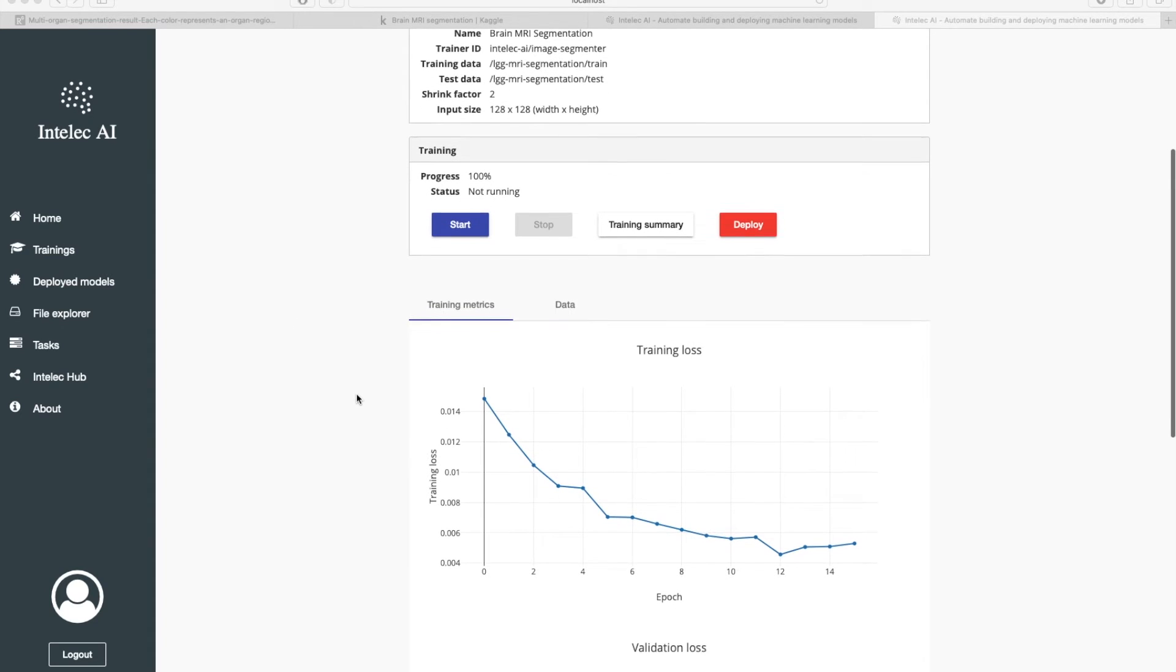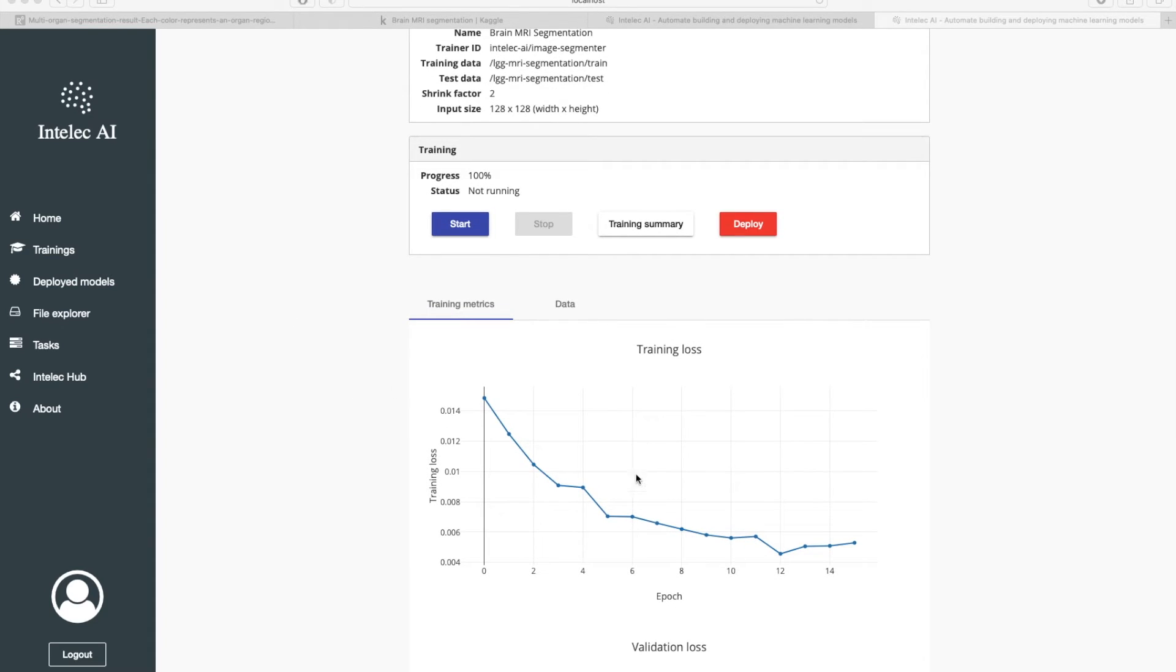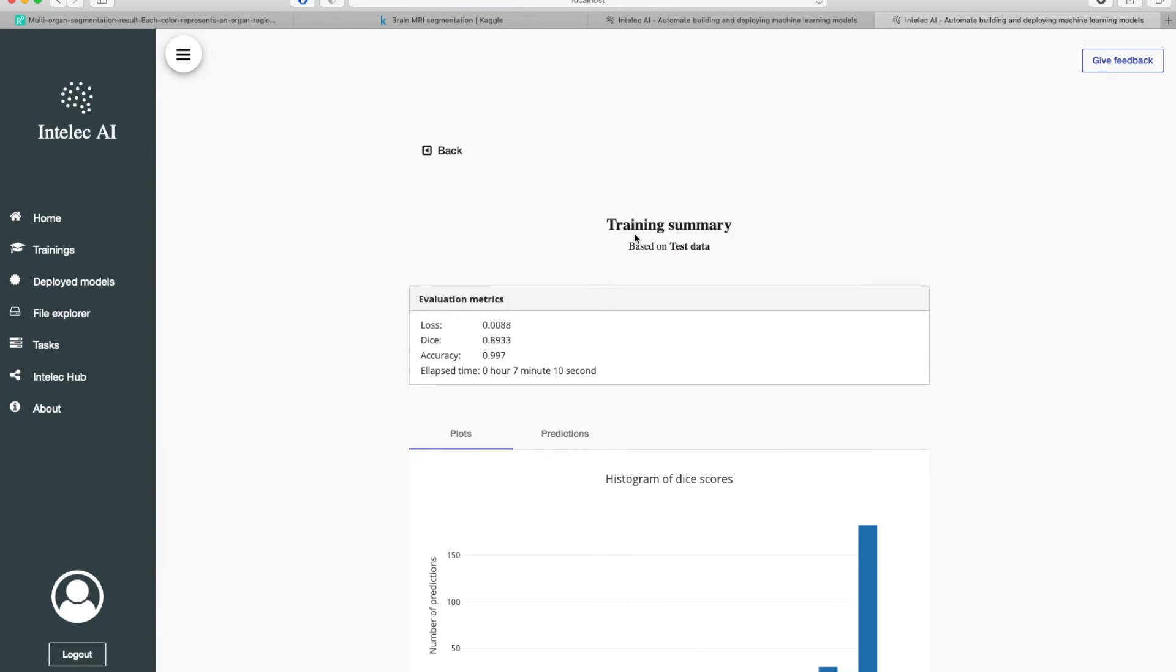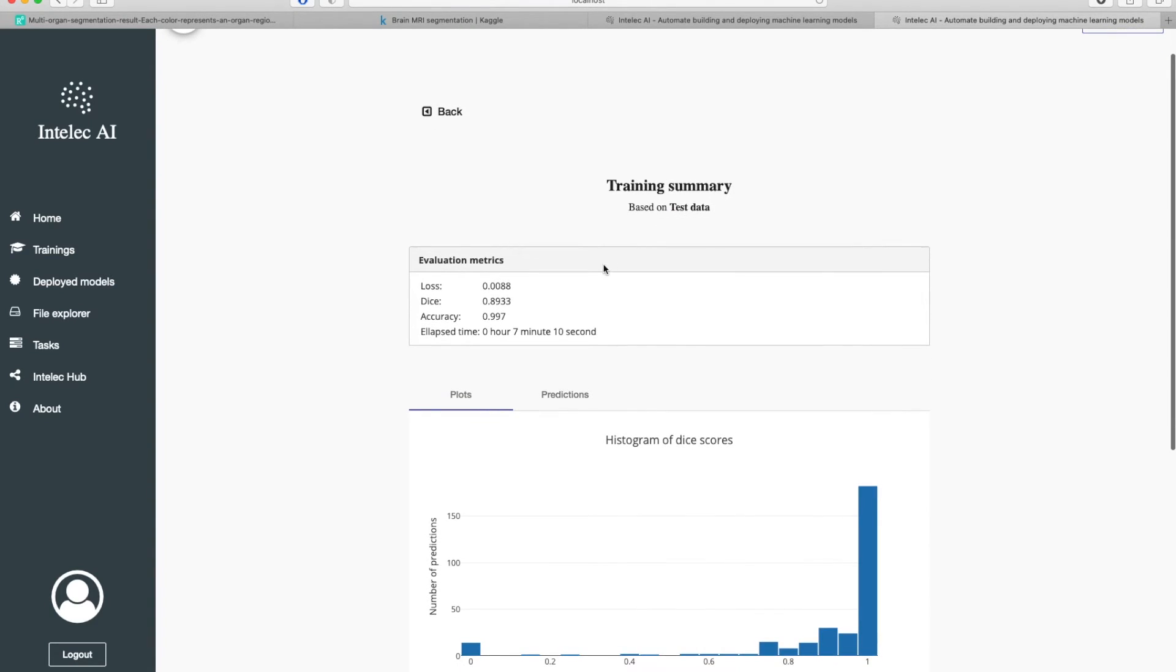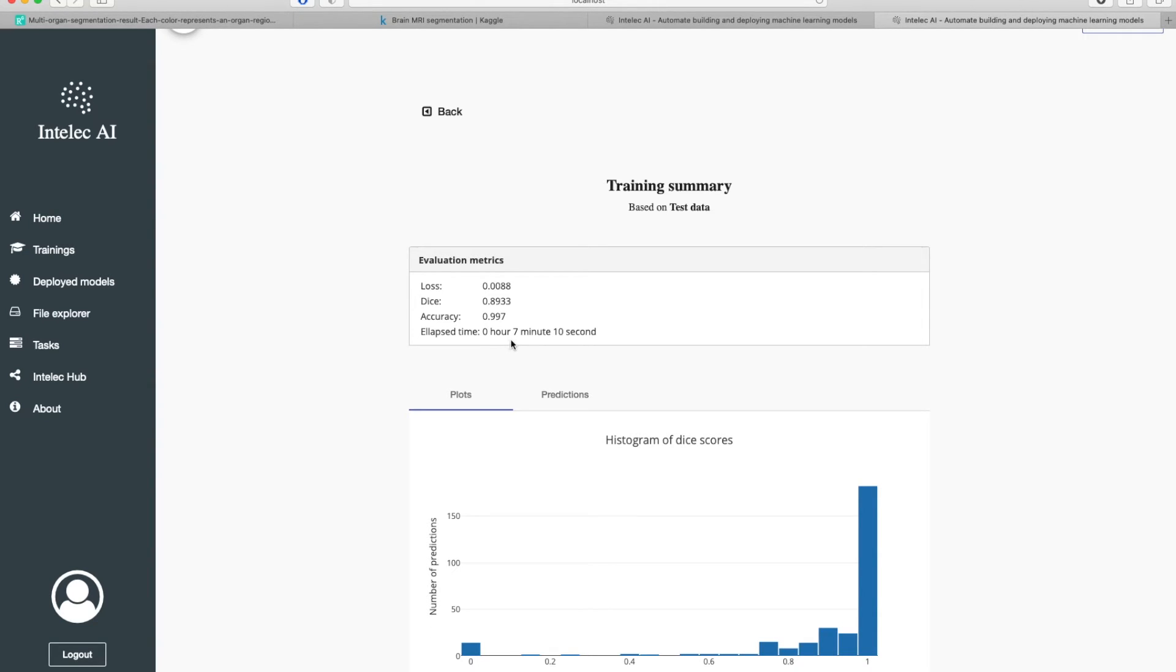Here we see how training loss decreased over time. Now I will check the training summary. Here we see the final loss, dice and accuracy scores. And we also see how long it took the trainer to train the model.